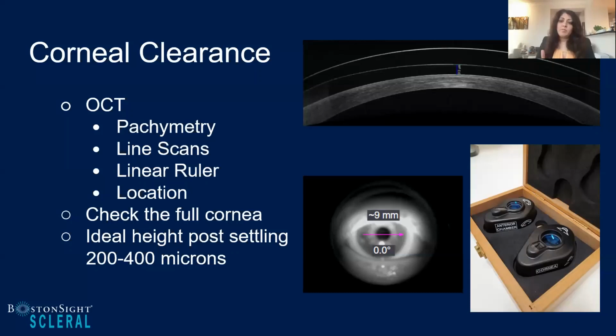And then I'll wait a good half an hour, 40 minutes before I take a look at that lens again. If I've got touch, then I'm going to change the lens until I have a lens that has enough clearance before I allow the lens to settle. How about you? What do you do?